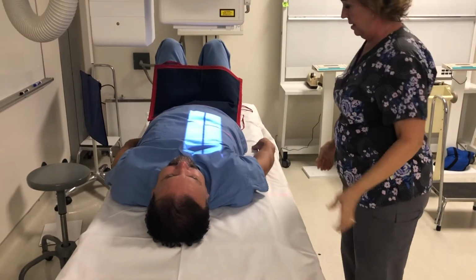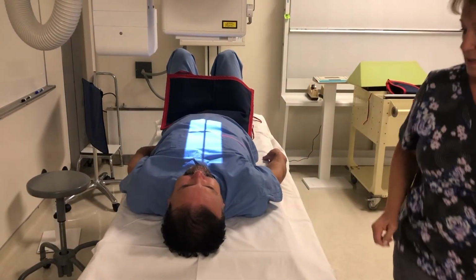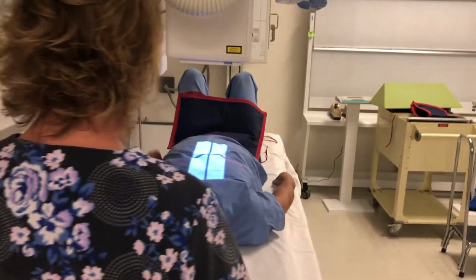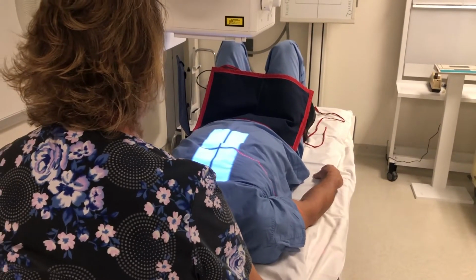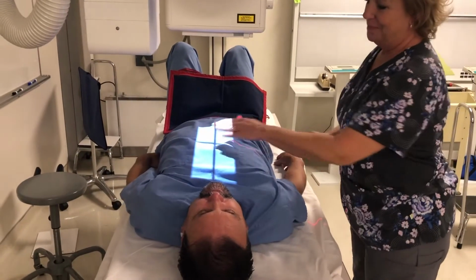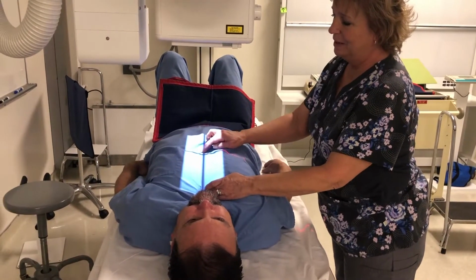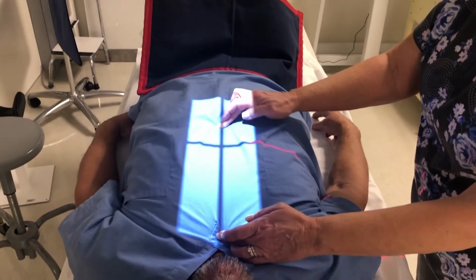Okay. I'm going to make sure that my patient is centered down the mid-sagittal plane of the table, so I'm going to turn him just a little bit. I'm centering midway between xiphoid tip and a manubrial notch.